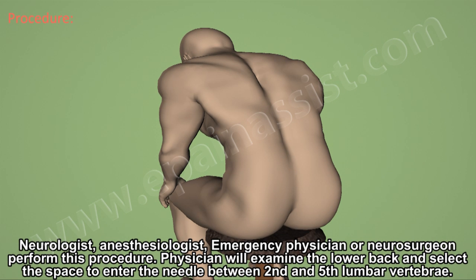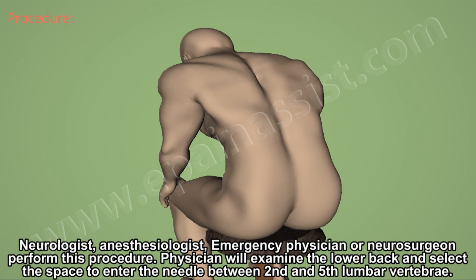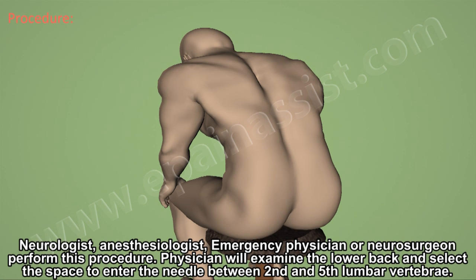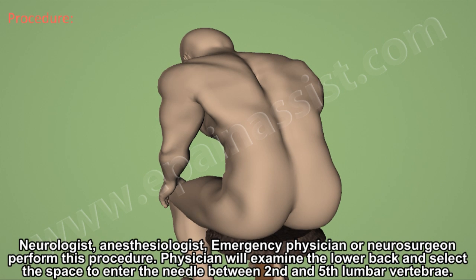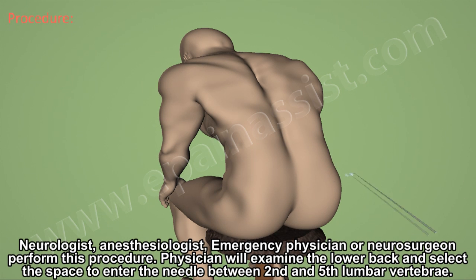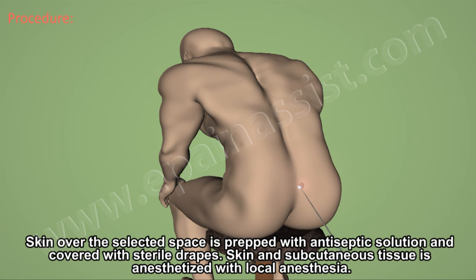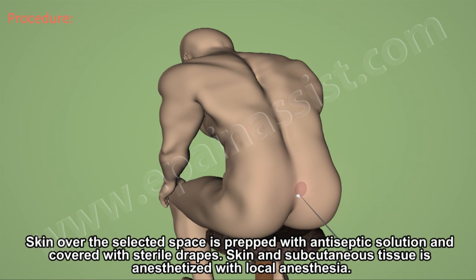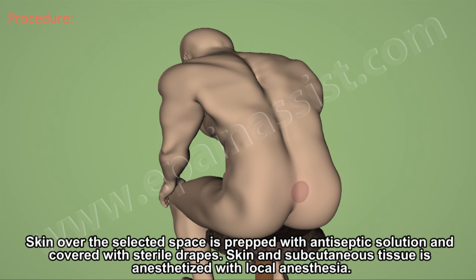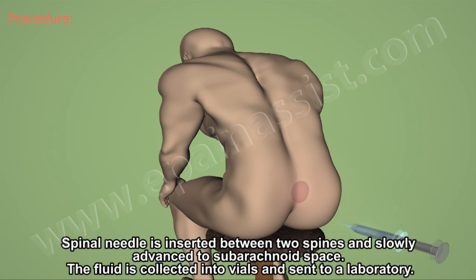A neurologist, anesthesiologist, emergency physician, or neurosurgeon performs the procedure. They examine the lower back and select the space to enter the needle between the second and fifth lumbar vertebrae. The skin over the selected space is prepped with antiseptic solution and covered with a sterile drape. The skin and subcutaneous tissue are anesthetized with local anesthesia.